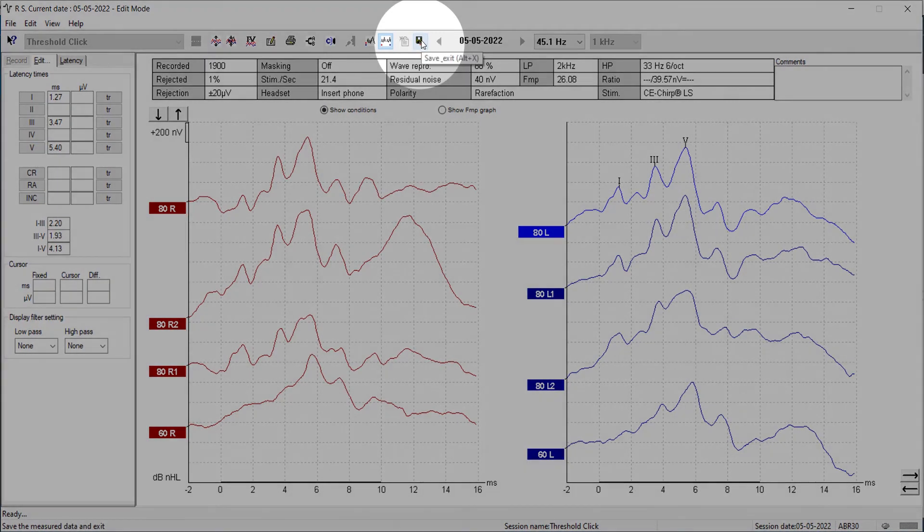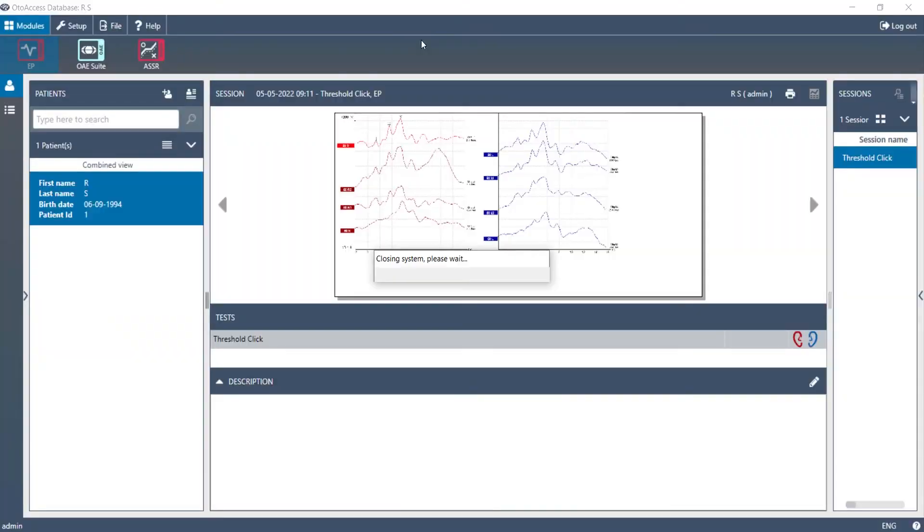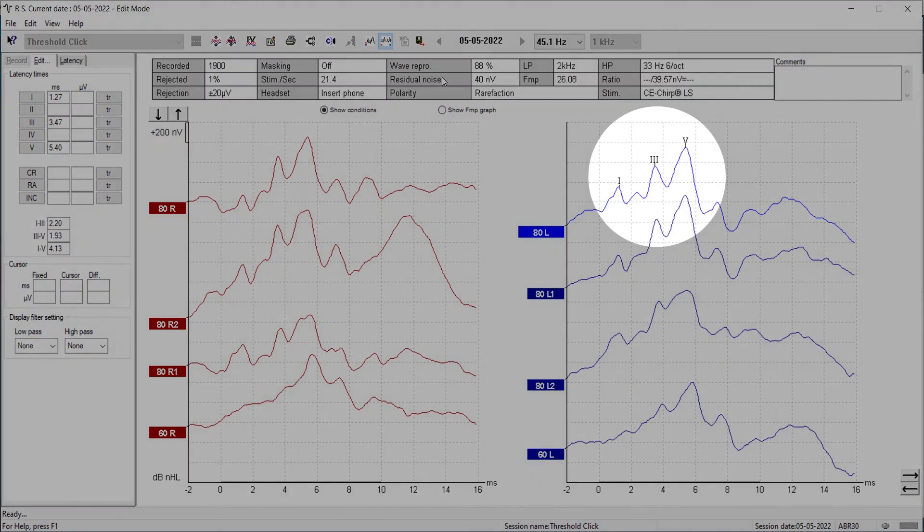Then press save. And if you were to open this session again, the markers are saved on the waveform.